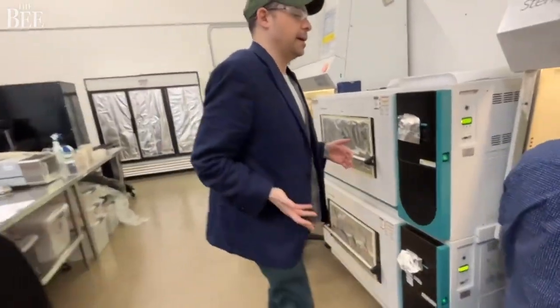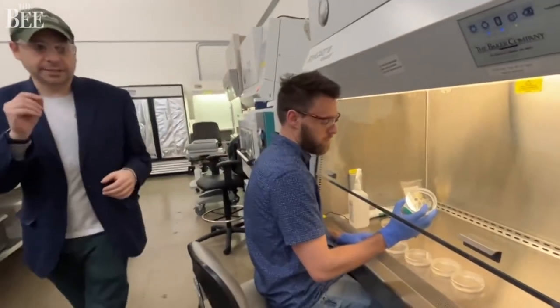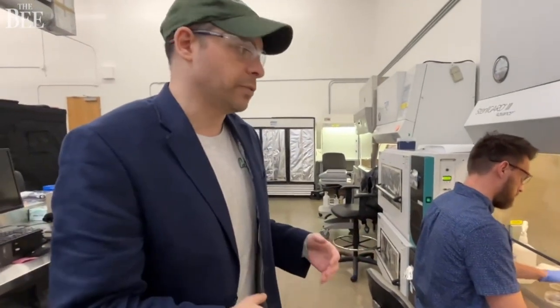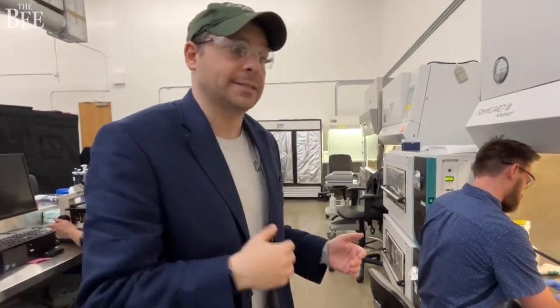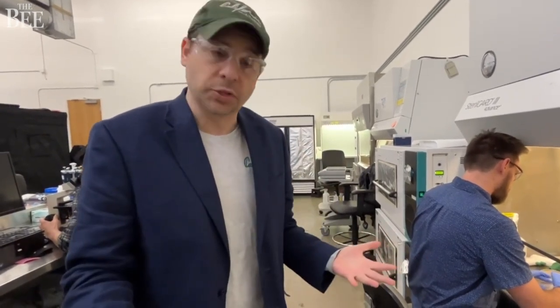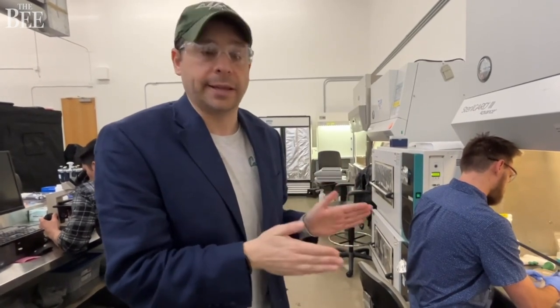Here is Erin working on selecting different cells that have different physical properties which we're looking for. Can they grow fast? Can they express the right flavors and smells of chocolate? And these are the things we're focusing on right now.